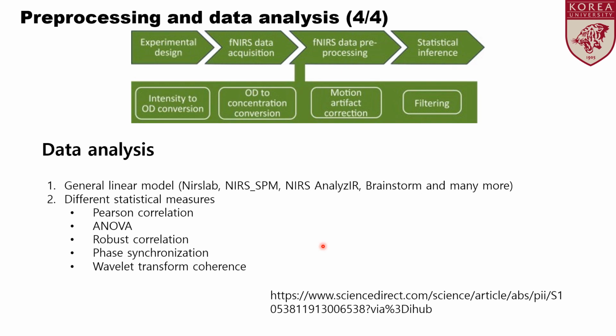Also, there are some statistical techniques to analyze the data, like Pearson correlation, ANOVA, robust correlation, phase synchronization, and wavelet transform coherence. Today I will not go deep into these statistical analysis techniques.